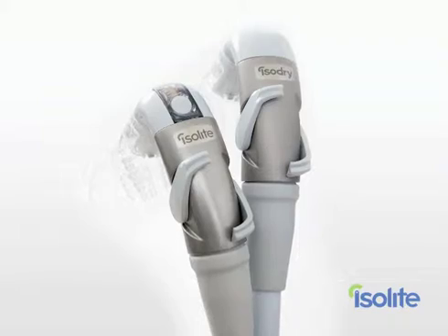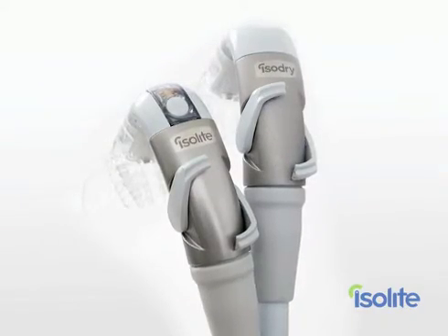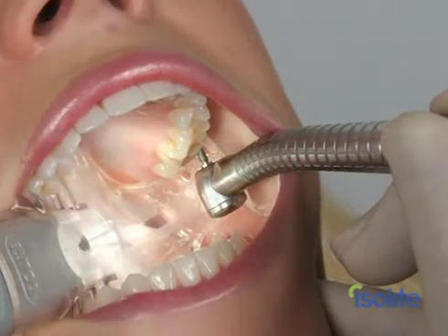In this video, we're going to cover all that you need to know to get started using your new Isolite or Isodry system. As with any new technology, it just takes a little practice getting used to it. But the great thing about using the Isolite is that it's fun and a big time saver for the entire team. Once you gain the confidence and skill, you'll quickly realize that procedures go 20 to 30% faster. You no longer have to fight the saliva, or the tongue, or that ever-loving clock.